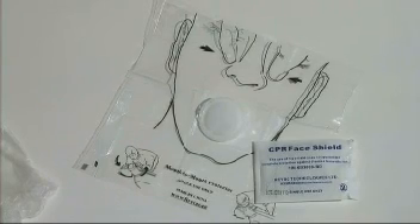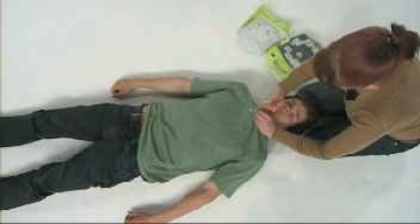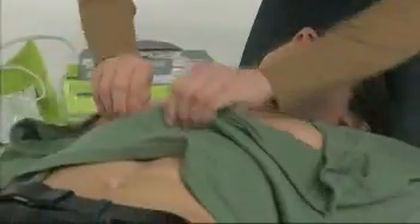A disposable face shield and gloves are also supplied for your protection. The electrodes need to be placed directly onto bare skin, so first remove all clothing covering the patient's chest.